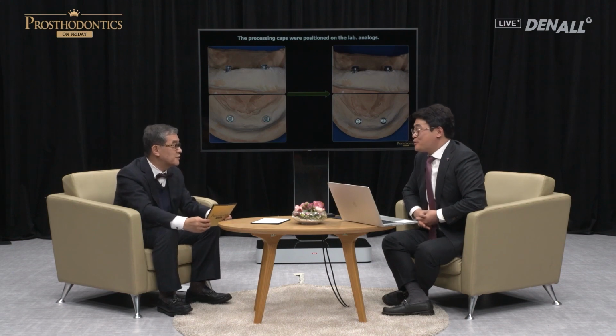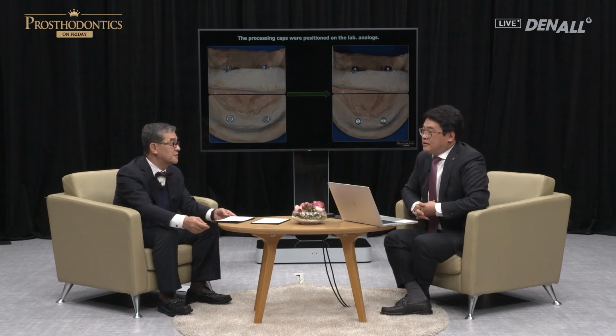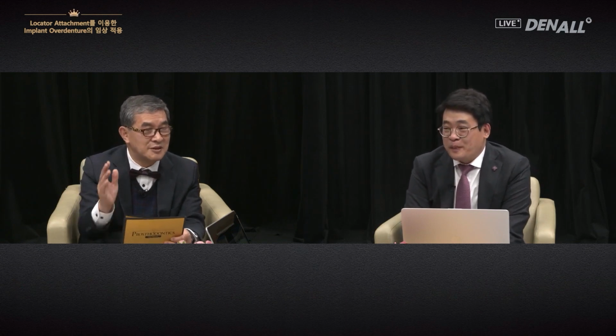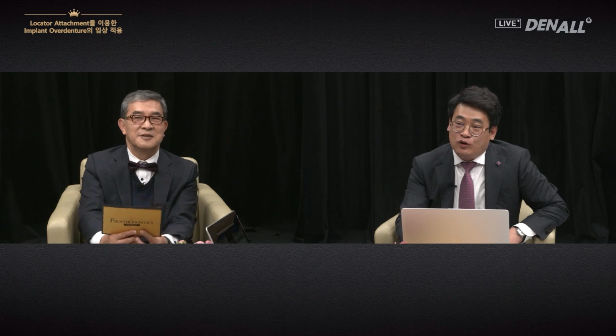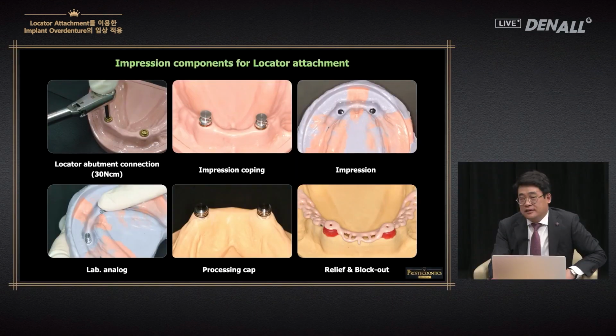This is how it's being introduced by the vendor. But for tissue-supported overdentures, I don't have the lab attach it. Me too. Rather than have the lab make everything, the lab provides the denture and does the preparation work, and when you attach it within the patient's mouth, the compatibility is the best because there's a lot of tissue support. I utterly agree with Professor Joe. Most people do it within the oral cavity. It's very rare to have it done at the lab. If you look at the catalog of a vendor, it is introduced like this. Yet personally, I don't do it like this.